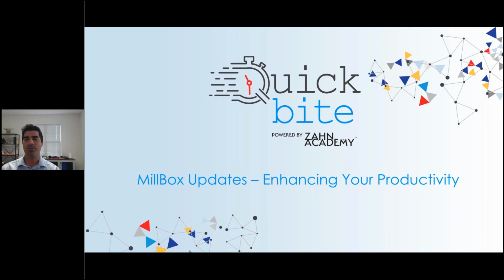I want to take this opportunity to just say thank you for using Millbox. I believe it's the very best CAM software in the world, hands down. And let's go through some of the features that make Millbox the greatest.